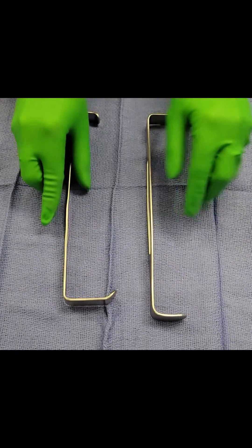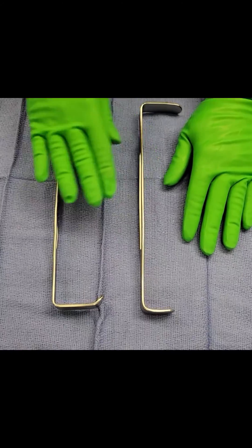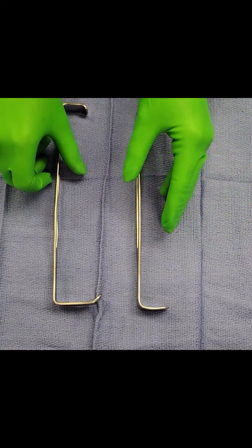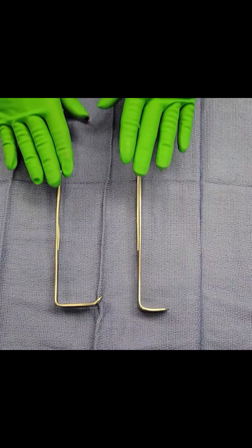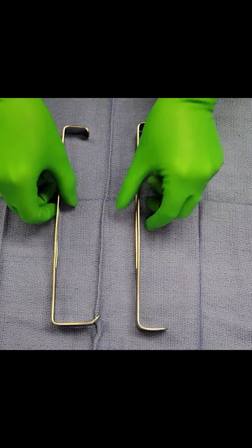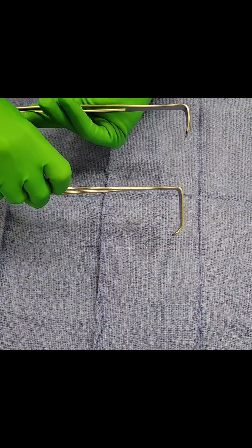So this is the Army-Navy retractor. You'll see it used in a variety of different surgical cases — it's very commonly used. It's used to retract shallow to superficial incisions, and there are two sizes: a short and a long.